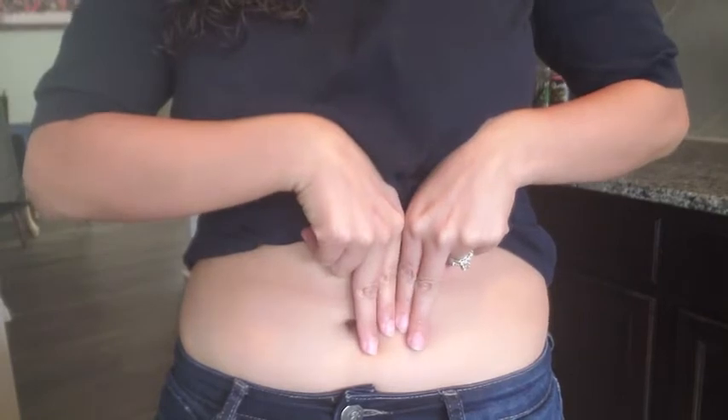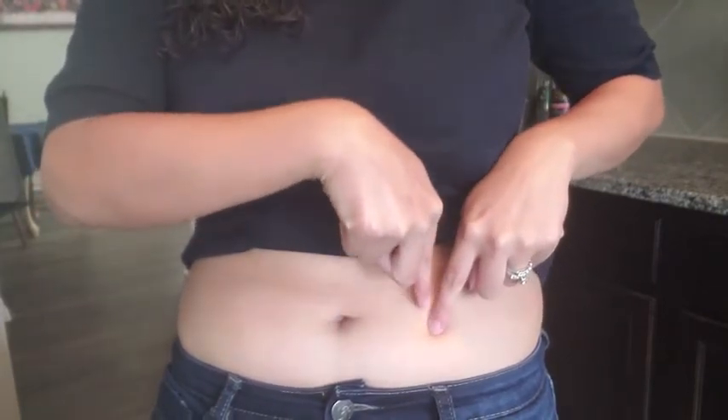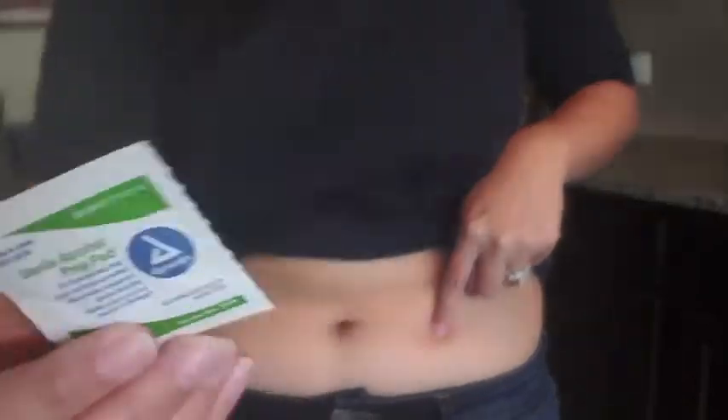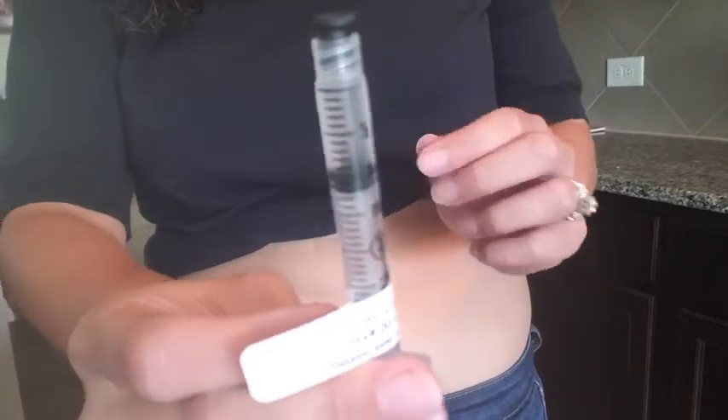You want to go about two inches away from your belly button. If you have to do more than one shot, alternate sides — right side of your belly button, then left. Then cleanse the area using your alcohol pad.